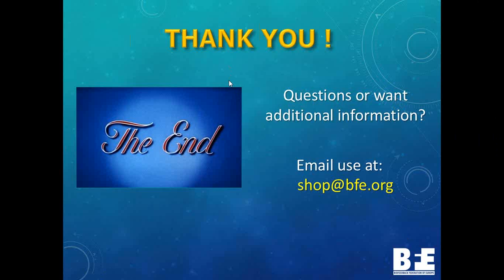The Thought Technology update, I think it's called BioGraph 6.2 is the official name. It's going to be coming out in the next year, and that's the one that's going to suddenly let you link to online videos and just stream them directly into your system. Obviously, you have to have an internet connection to do that, but it's really, really cool, and I'm super excited about those features.